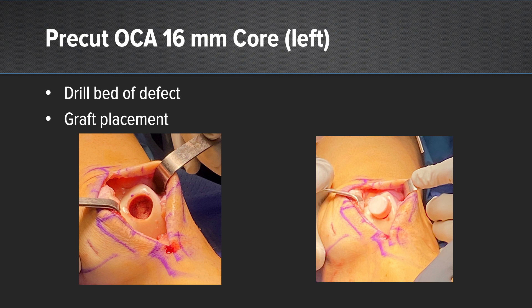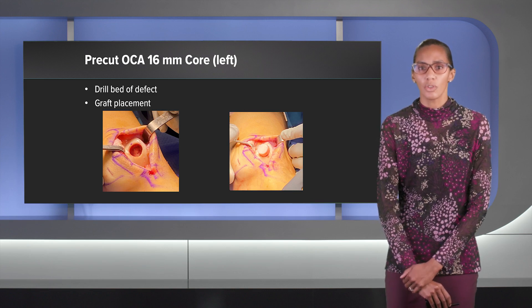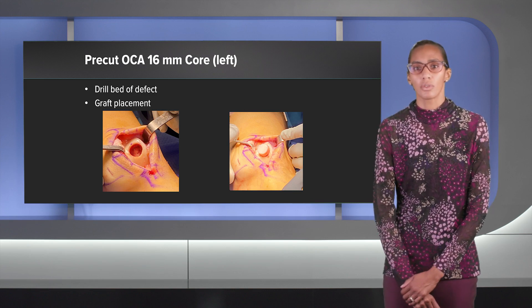Once I'm done reaming, I usually drill the bed of that defect to allow some optimal bone healing. Then I can place that graft. A tip is that you can put a suture underneath that graft, and if you don't want to commit, start tapping it in lightly. If you don't like the way it's fitting, you can use that suture to pull the graft out and readjust.